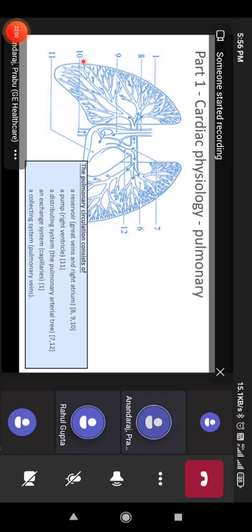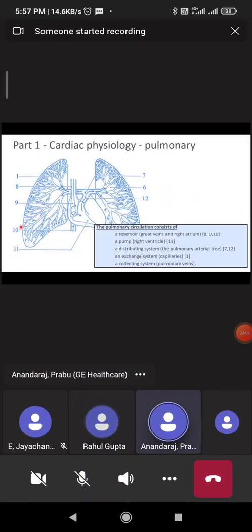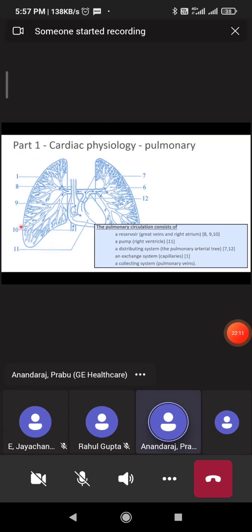Okay, sir. But if it is in a non-steady state, I mean, we will be talking about steady state, right? When we are talking about FRC or metabolic monitoring. If the patient is in a non-steady state, at that time, if they are doing an ABG and introducing that value, then I had seen that our ventilator reads 40 liters per minute cardiac output, which is crazy. Even an elephant won't have such a cardiac output.